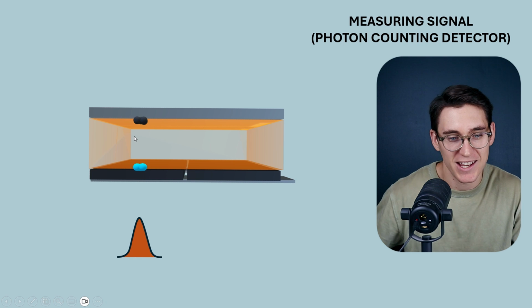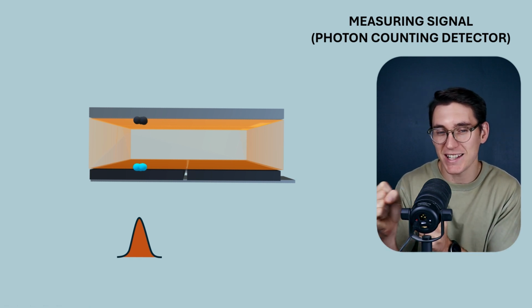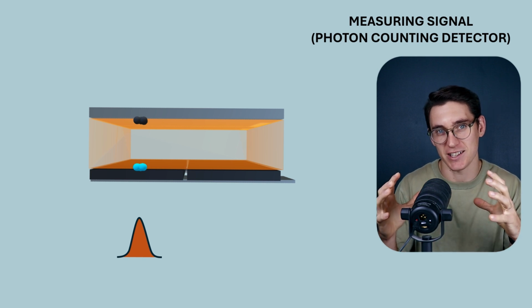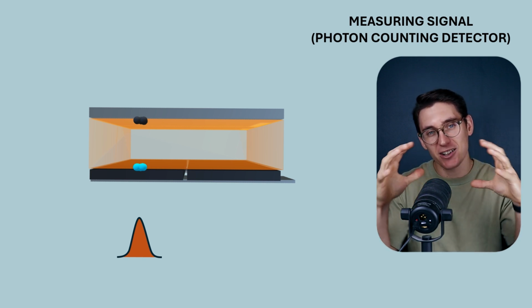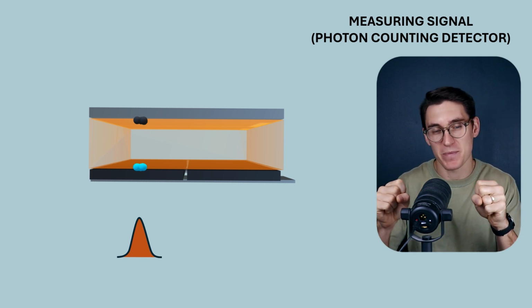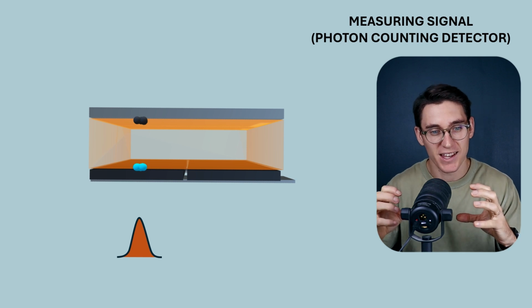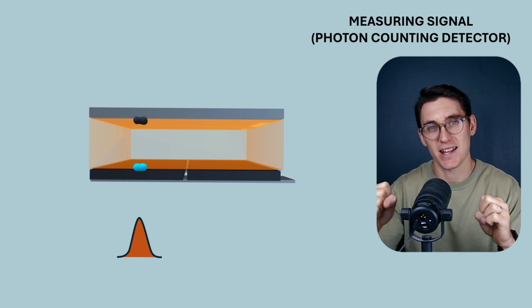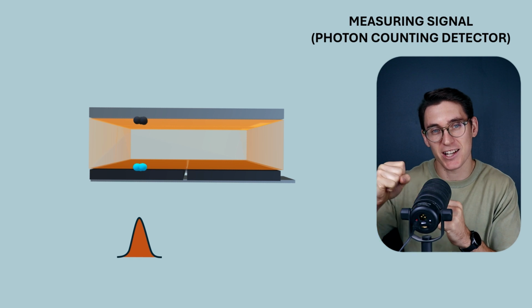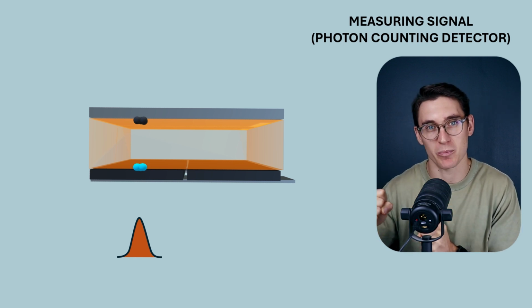What happens here is that an electron in that semiconductor layer is going to be released from the valence shell that it's in. We think of the outermost electrons in the outermost orbital that's actually filled with electrons as valence electrons. They fill an energy band known as the valence band. If energy is deposited into that system, those electrons can get enough energy to be released from the valence band and enter what's known as the conduction band.